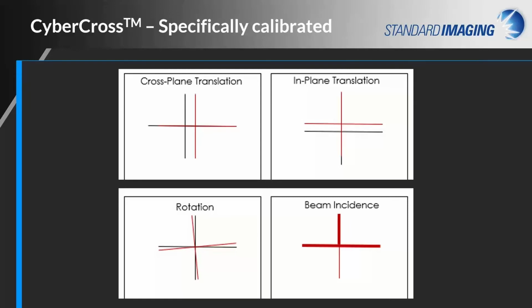The CyberCross uses a lens to create a laser crosshair. As such, the device requires a simple calibration procedure before first use. Note that this calibration will be machine-specific. Adjusting the lens affects the shape, line thickness, and location centering of the crosshair.